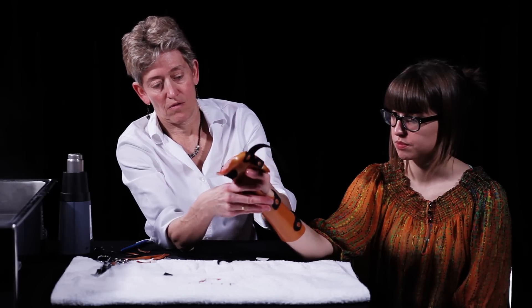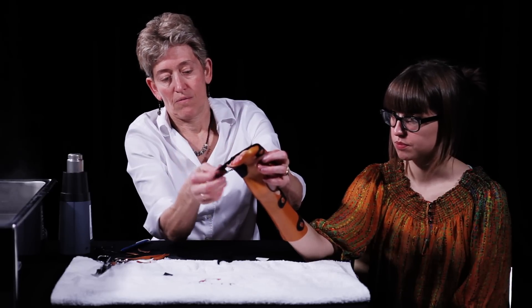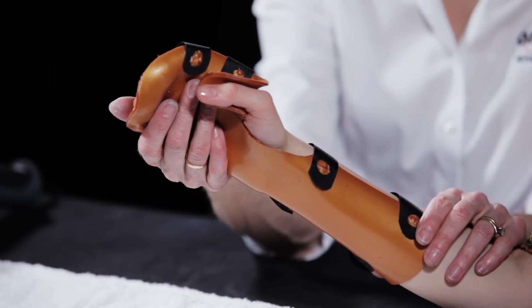Using Orfit Colors NS in all 8 color choices allows you to make bright and bold therapeutic orthoses which your patients will enjoy wearing.